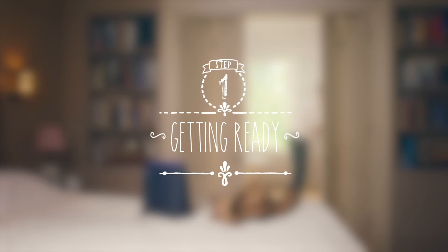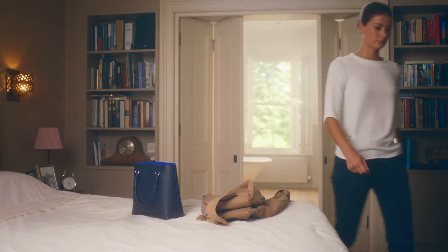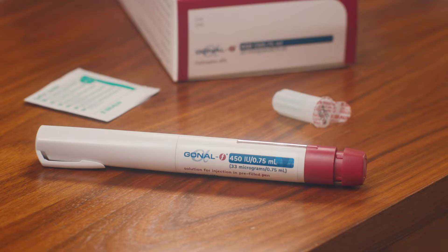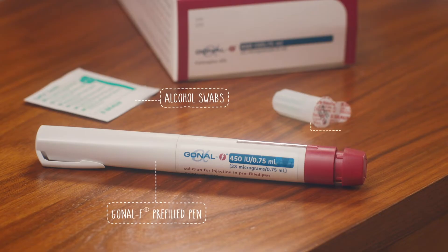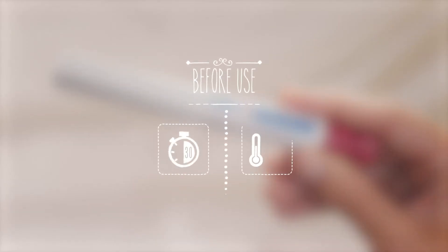As well as watching this video, make sure you read the leaflet that comes in your pack with your pen. But before you get started, make sure you've washed your hands properly, just like I did. You'll also need to make sure you have all the things you need for your injection: the Gonal F pre-filled pen, alcohol swabs, and a needle. If you're keeping your pen in the fridge, it's best if you take it out about half an hour before you want to inject, to let it get to room temperature. That will make it a bit more comfortable when you inject.